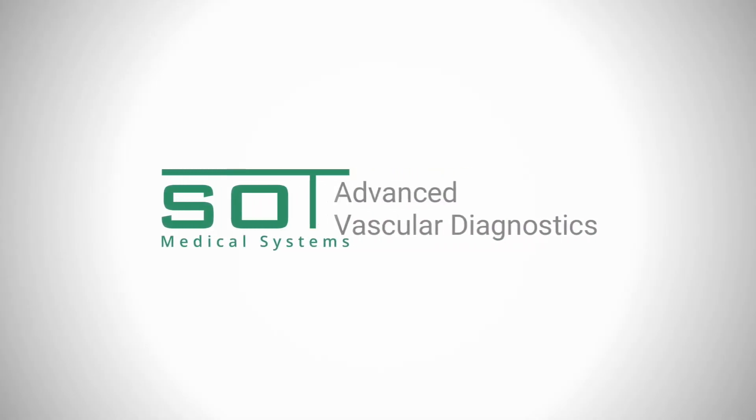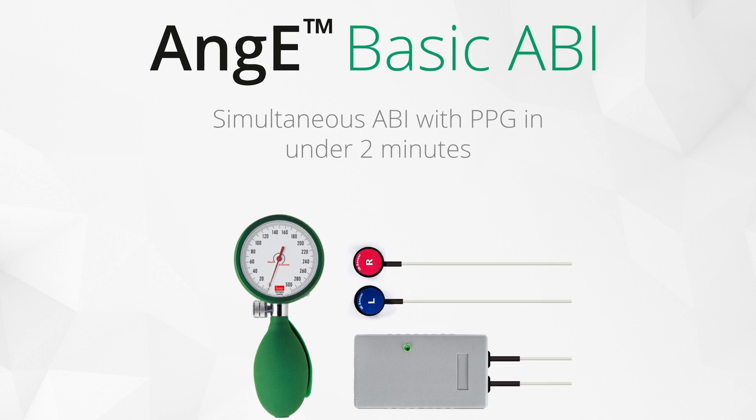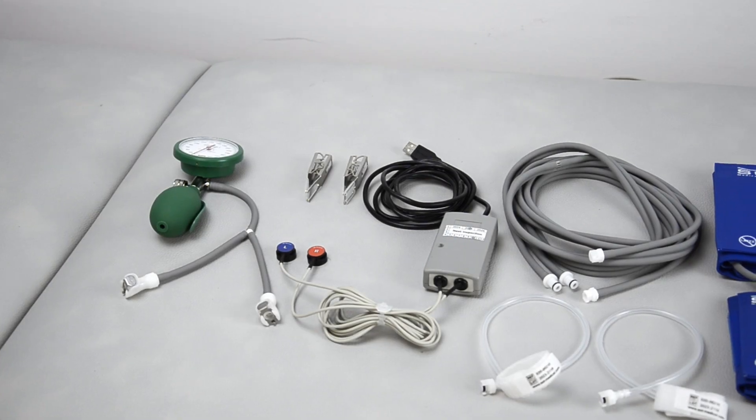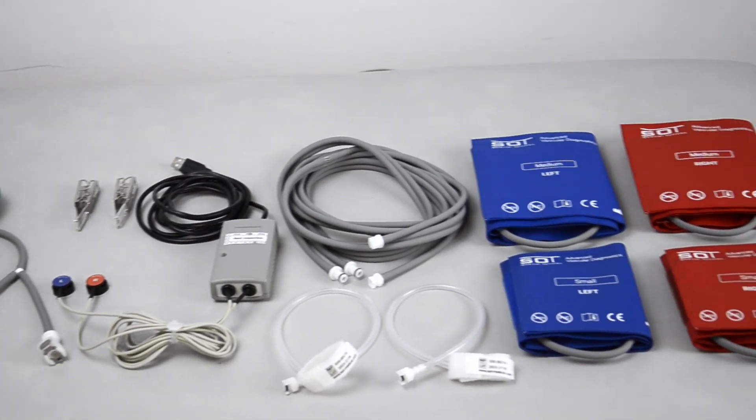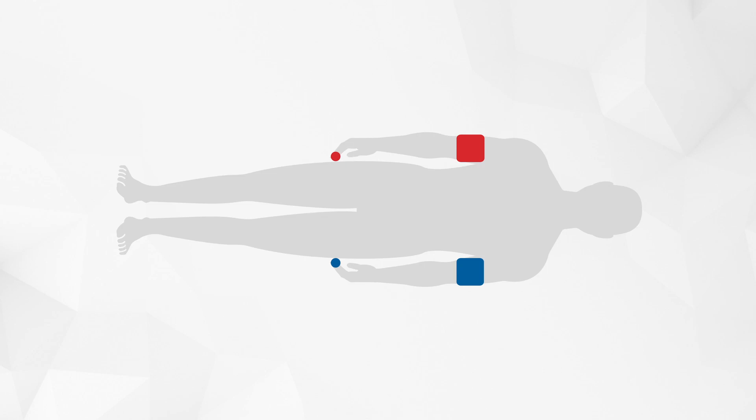The ANG BASIC ABI is an easy-to-use system for measuring ABI, TBI and pulse waves. It works with optical PPG sensors and blood pressure cuffs that are operated with a hand pump. This allows for a simultaneous measurement of the left and right side of the body at the same time for the most precise comparison.